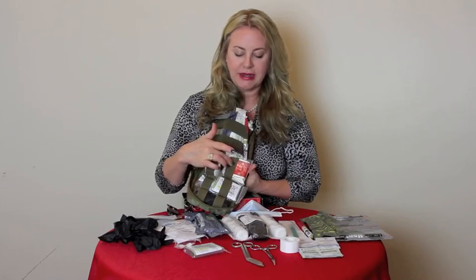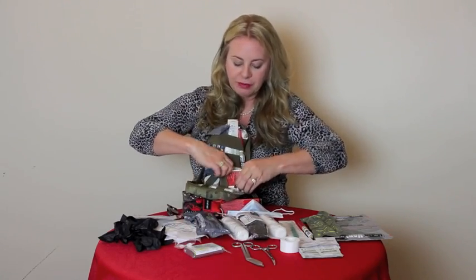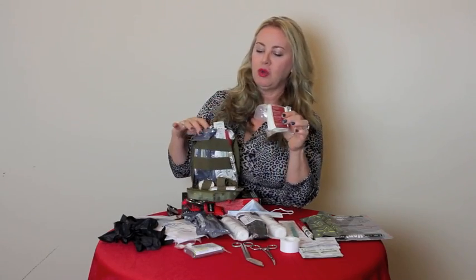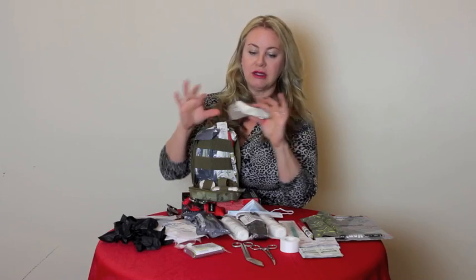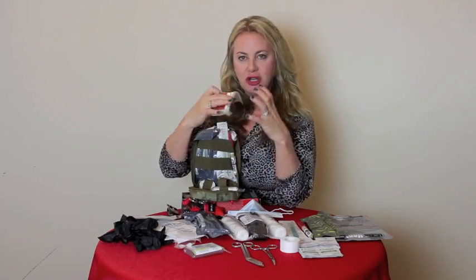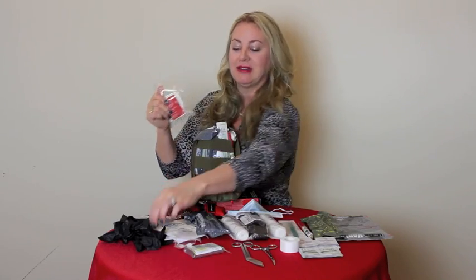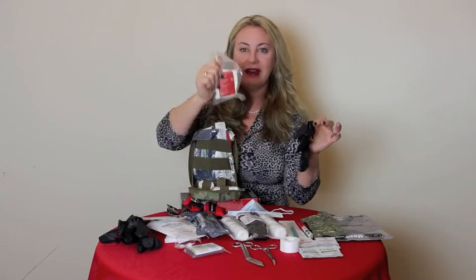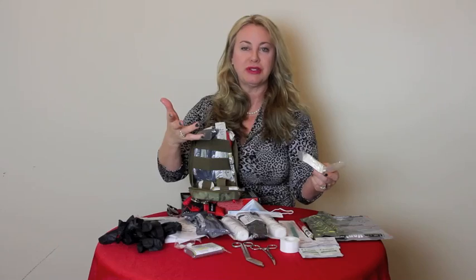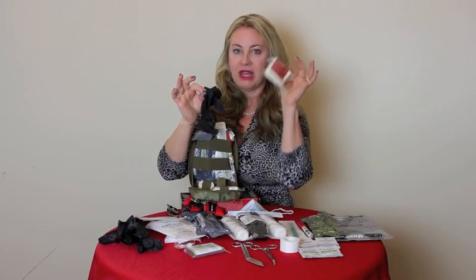The next section has an H&H dressing. Now the H&H dressing is very interesting because it looks like this tiny little square. But you would be absolutely shocked. If you open this up, which I have done many, many times, it turns into this giant pile of gauze. What better to stop bleeding than a gloved hand and a wad of gauze? Bam! Compression. 80 to 90% of bleeding stops with compression. So remember, gloved hand, gauze.